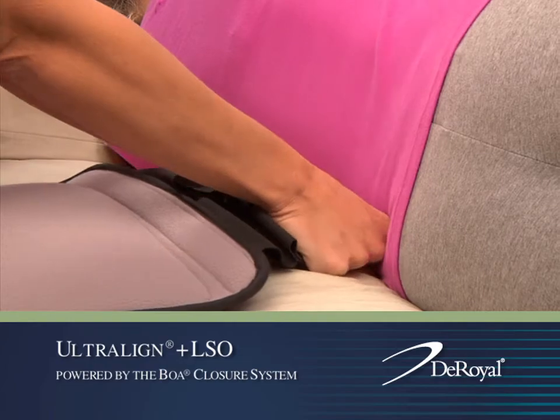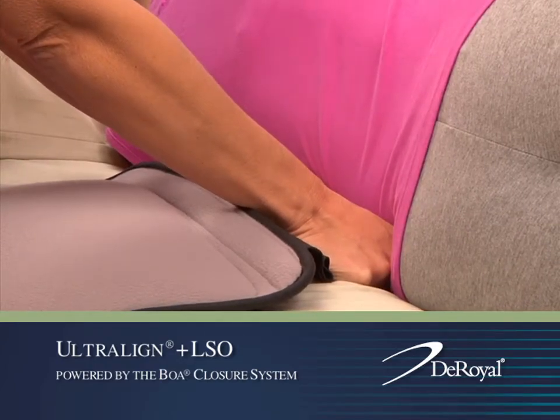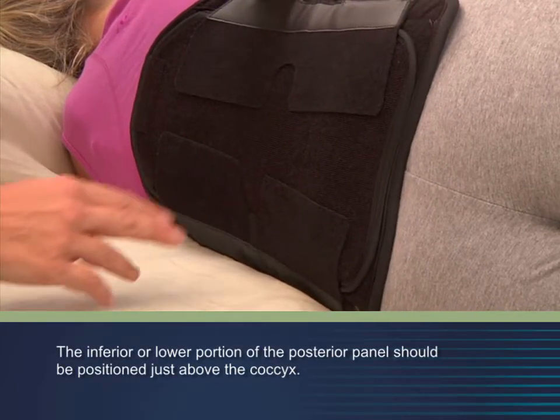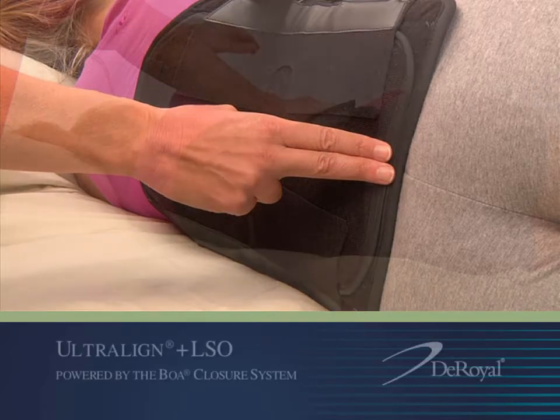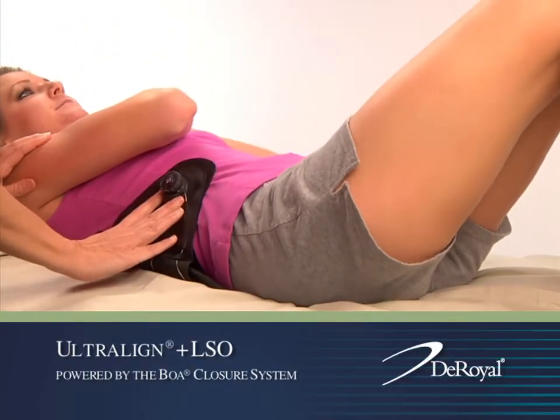To apply the orthosis, tuck or slide the closure under the patient's lower back so that it can be retrieved on the other side. The inferior or lower portion of the posterior panel should be positioned just above the coccyx. Next, roll the patient back into the supine position.